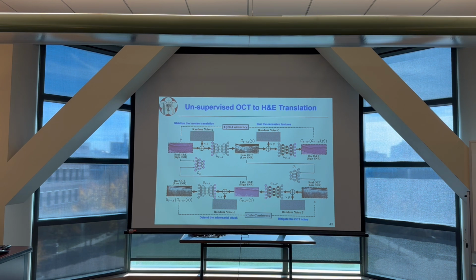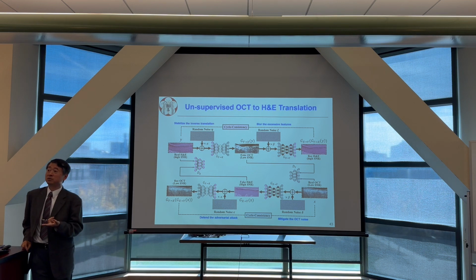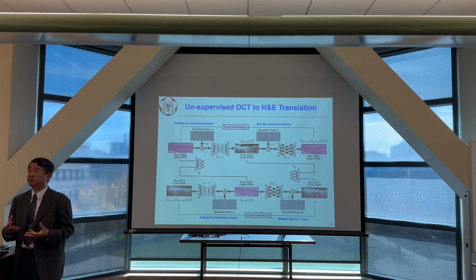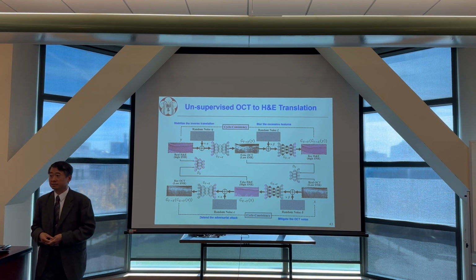No, different a lot. For example, the thickness of your stratum corneum on your face is very thin, but on your foot is very thick. Yeah, so at different locations, quite different. Right now, for basal cell carcinoma, it quite frequently happens on your face. But I think you are right. That's why people need big data. You got to have data from different locations. Then you can train the algorithm well, right?